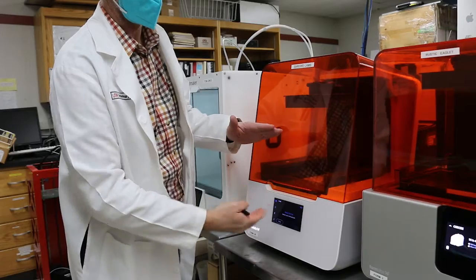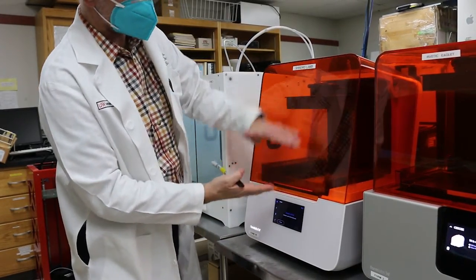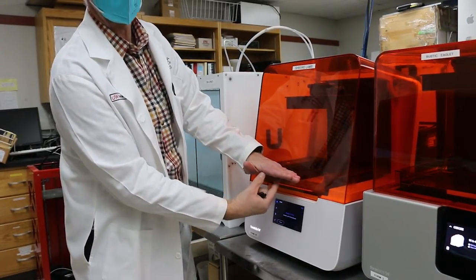The end result is a skull that's had the tumor removed, and we then can use these three-dimensional computer models and print them on a three-dimensional printer. Those three-dimensional models can be used in our hands to study the approaches and utilize in surgery to help make sure that we stick within our margins, our original surgical plan.